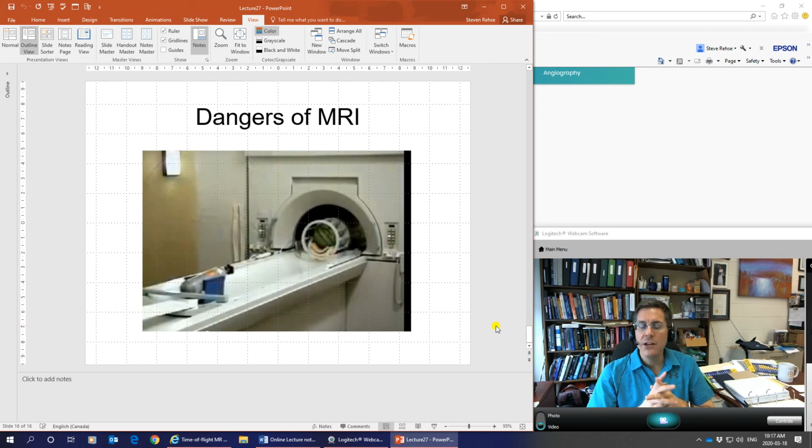All right, if you've ever had to go into an MR, or if you ever see an MR, the patient is going to be wearing headphones like this. It's so the nurses can communicate with them, but also it's bloody loud. If you ever see these things, it's like bang, bang, bang, bang, bang. It sounds like somebody's hitting the side of the machine with a hammer, for real. It's really loud. That banging is these gradient fields. Slice selection, phase encode, frequency encode.